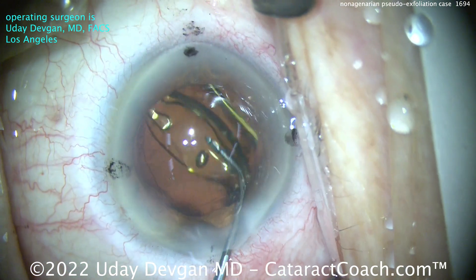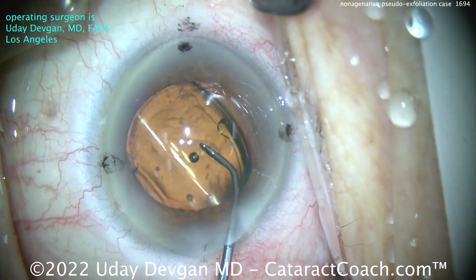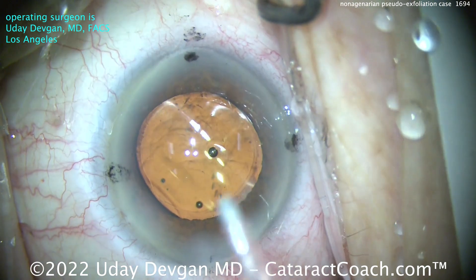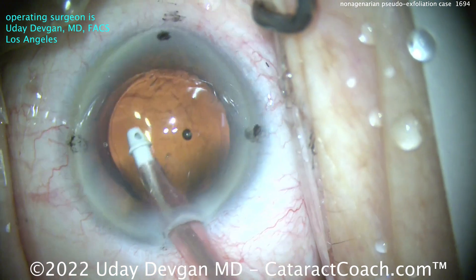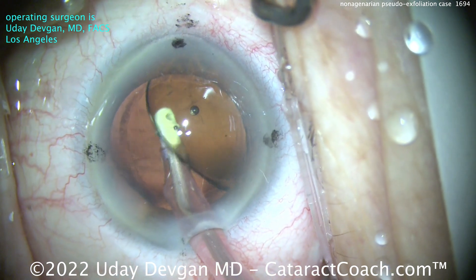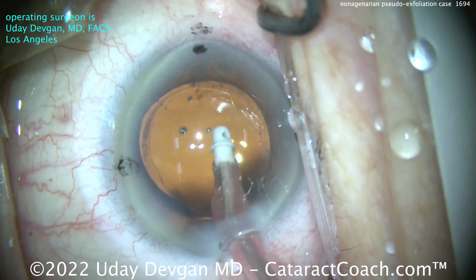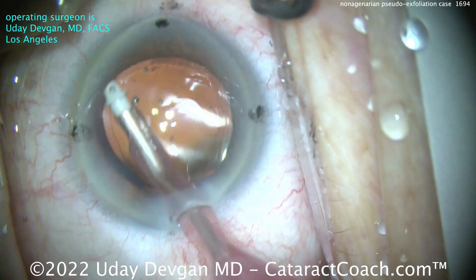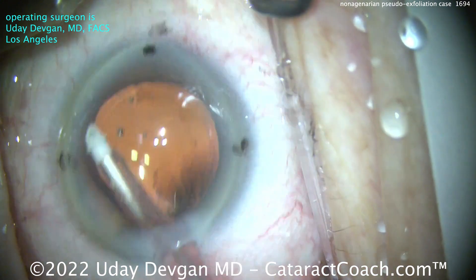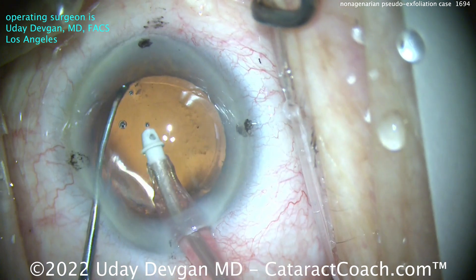Monofocal acrylic lens. If you've got a 90-plus-year-old macula, you want a monofocal lens. Don't tell me how that 90-something-year-old macula is itching for a multifocal or trifocal lens. So let's clean this up — take out the viscoelastic. A little bit of capsule polishing. Now we've just got to get that IOL aligned with those toric marks.